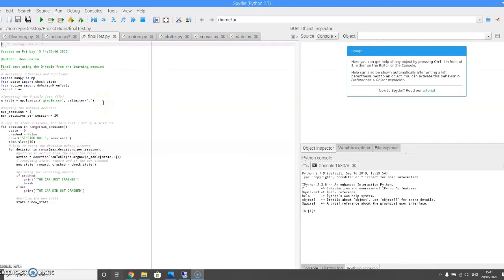For the final test, we implement the Q-table that was saved from the learning sessions. The number of sessions this time is set to be 4, and per session, the maximum decisions are set to be 20. As this is the final test, the actions permitted for the agent are only the ones that it can retrieve from the Q-table. From those actions, we can check then the state, get the new state, the reward, and if the car crashed or not. If the car crashed, we will print out a label and the session will be broken; else the car will be successful as it did not crash.